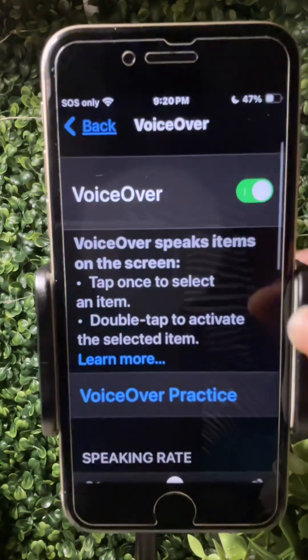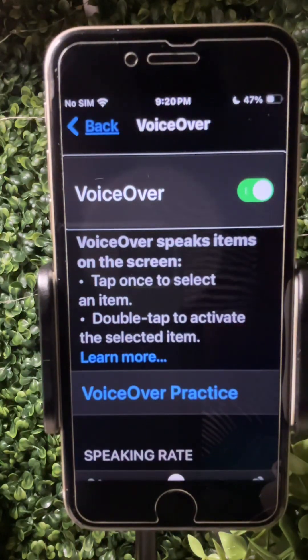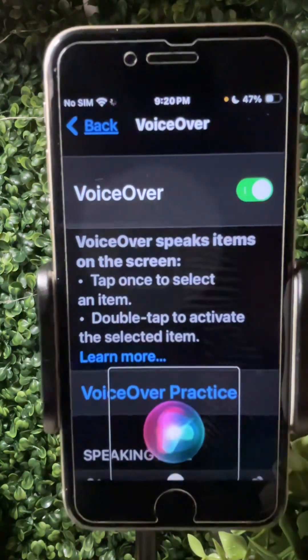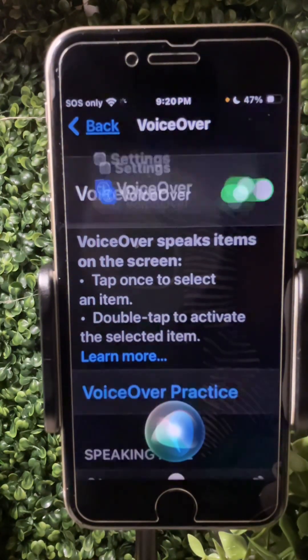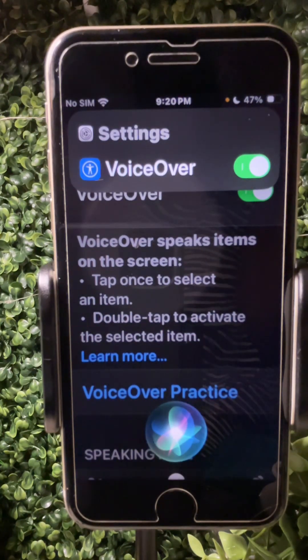If you get stuck using VoiceOver and want to turn it off and you have a phone with a home button, you can press it — one, two, three — and it says 'Turn off VoiceOver' and it turns it off. You can do the same to turn it back on.